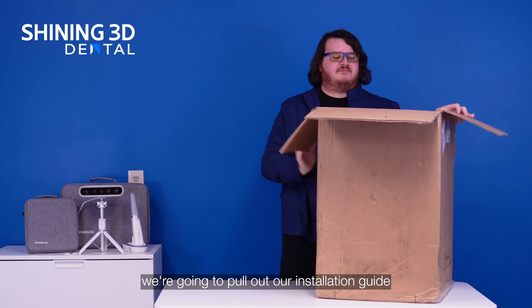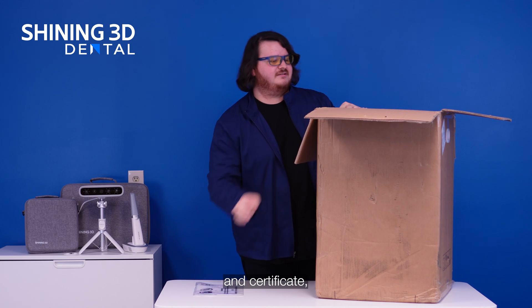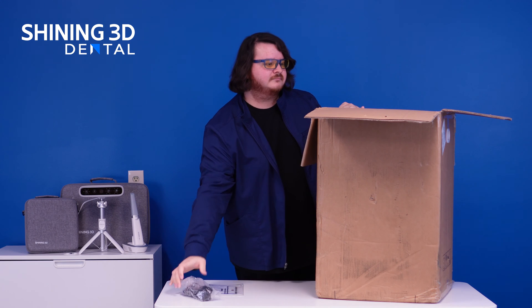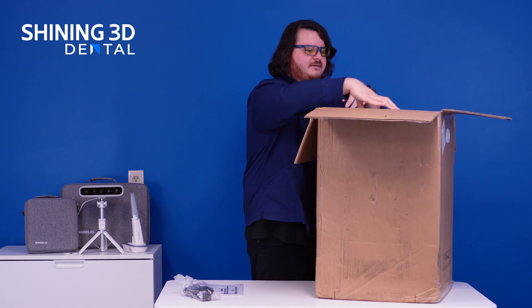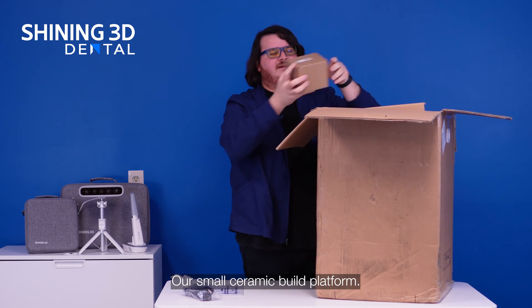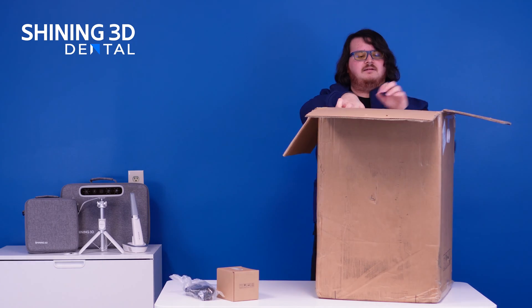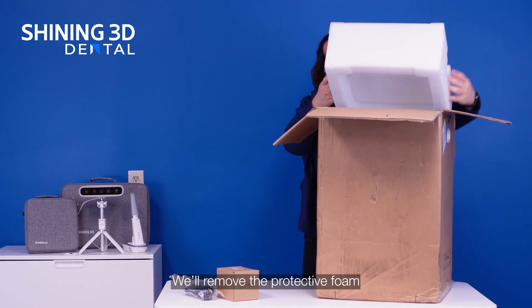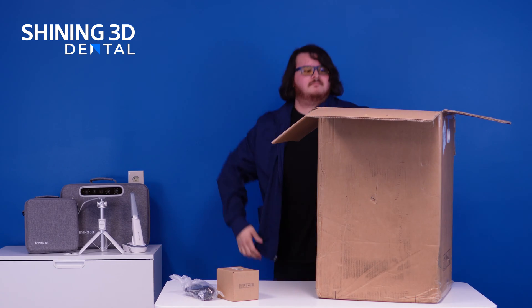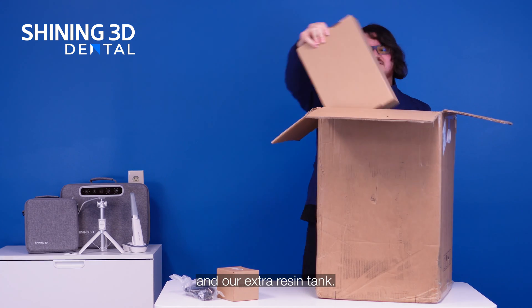First, in the box we're going to pull out our installation guide and certificate, power cable, our small ceramic build platform. We'll remove the protective foam, and here is our extra resin tank.